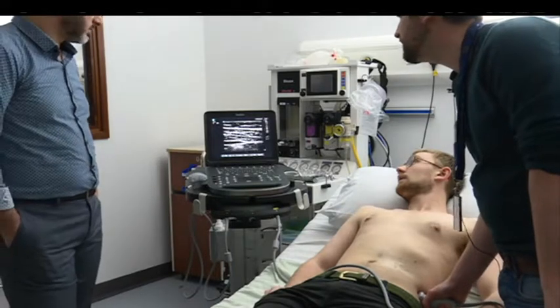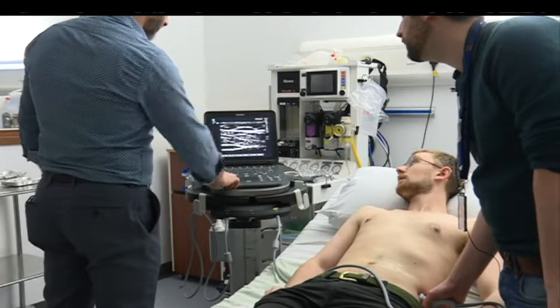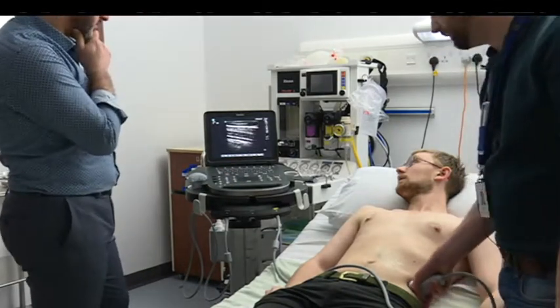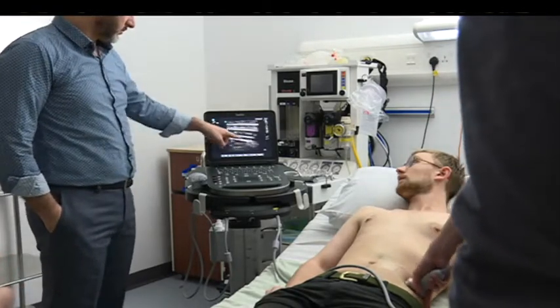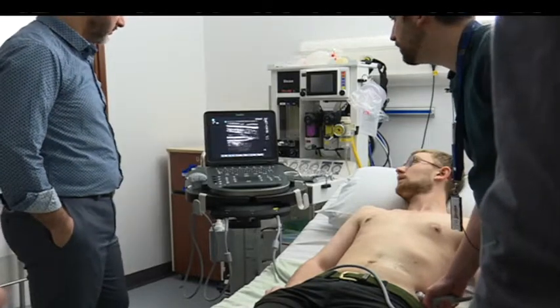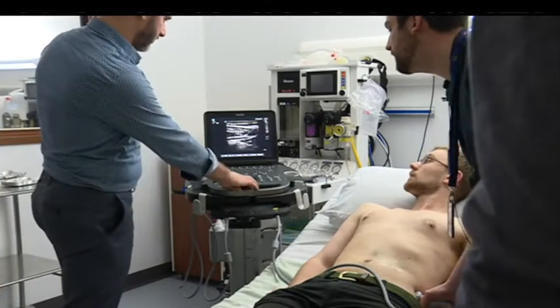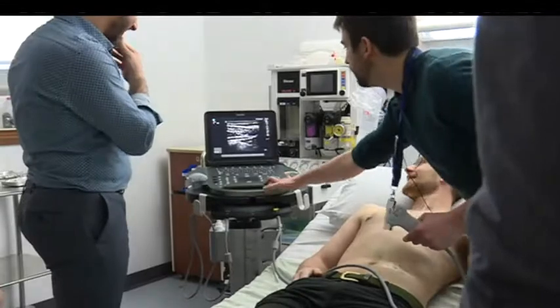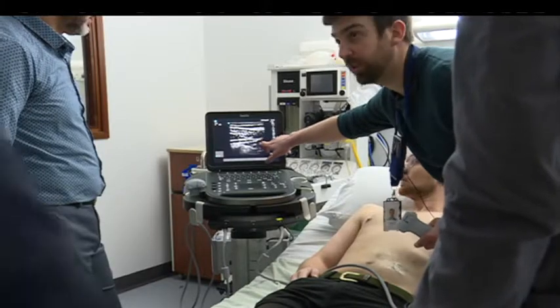Making the image deeper — okay, coming in here now. We've got the transversus abdominis and look below it. As I come around you can see there's also another muscle there, especially if I go lower. So you've got the transversus abdominis ending here, and that other muscle is the quadratus lumborum.